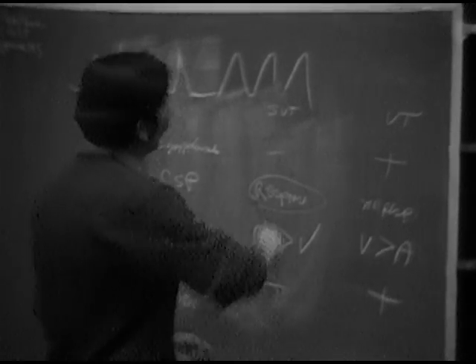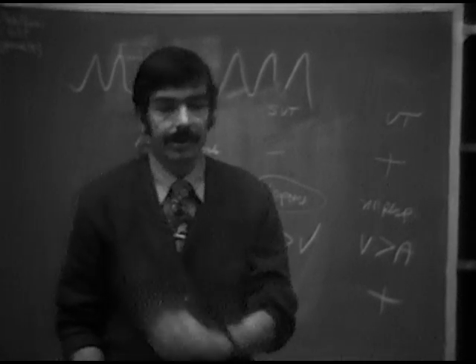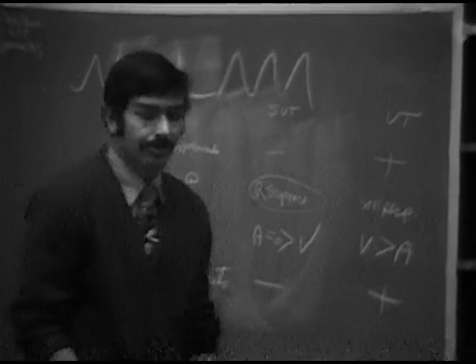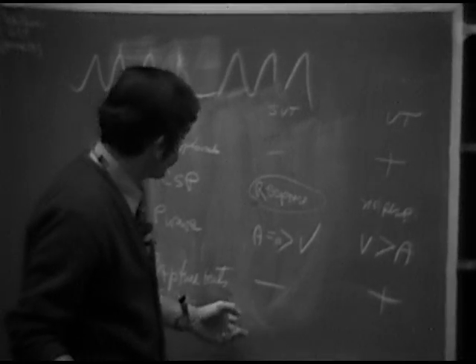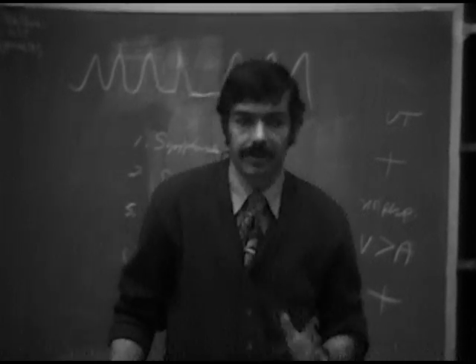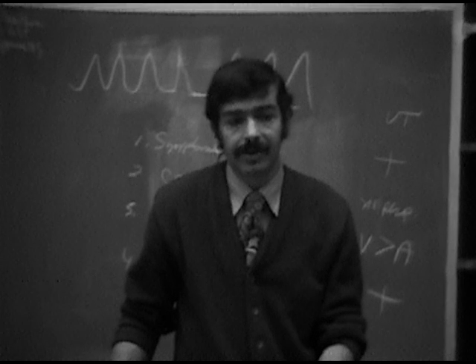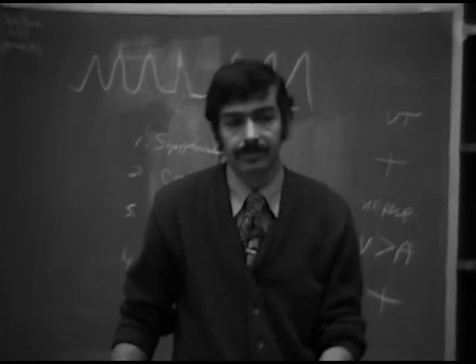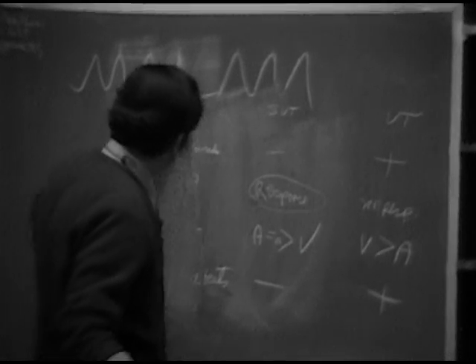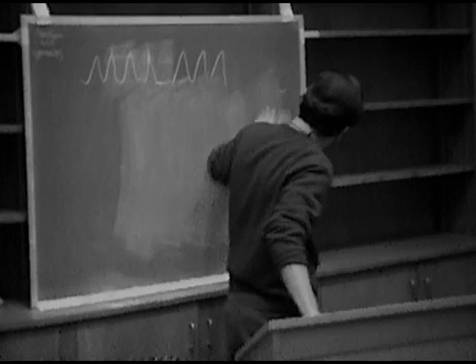One of the reasons is that ventricular tachycardia itself is not perfectly regular. And some people use that as a differentiating point between supraventricular tachycardia and ventricular tachycardia. But you can try to use it, though I've frankly found that this is not too helpful. In a practical situation, I haven't found that to be much use. People are always bringing it up, and we're always seeing exceptions.